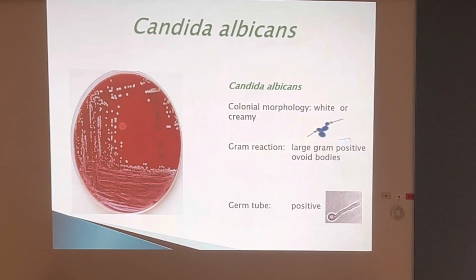After incubation, we take a sample of that fluid that would have contained the growth of the yeast, place that onto a microscope slide with a cover slip, and we observe. Now, what we're observing for is the formation of germ tubes. A germ tube is simply a hyphal outgrowth from the yeast cell itself. For a positive germ tube, you should have no constriction between the hyphal outgrowth and the yeast cell.